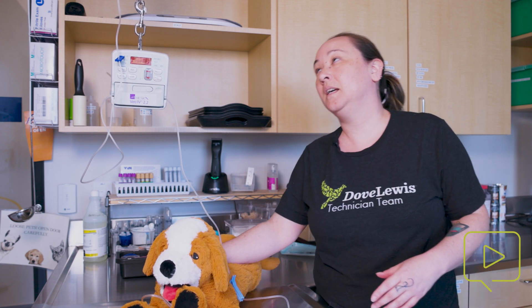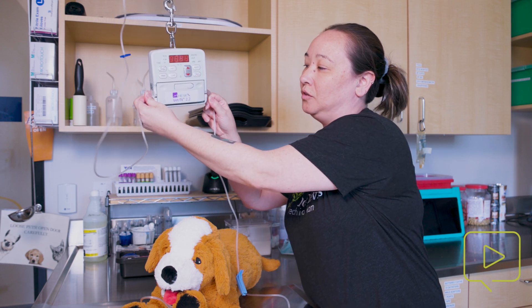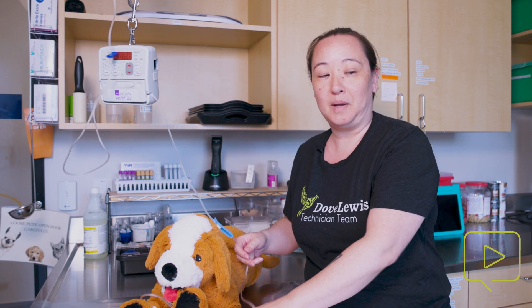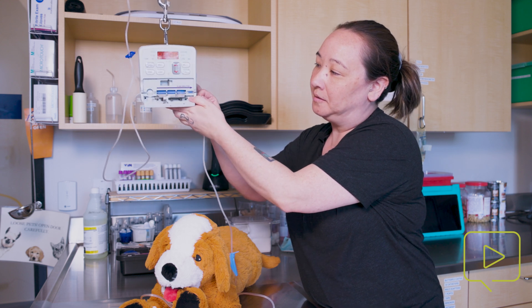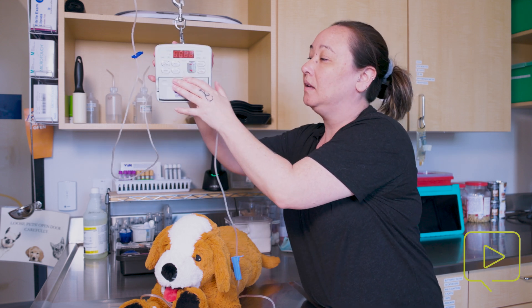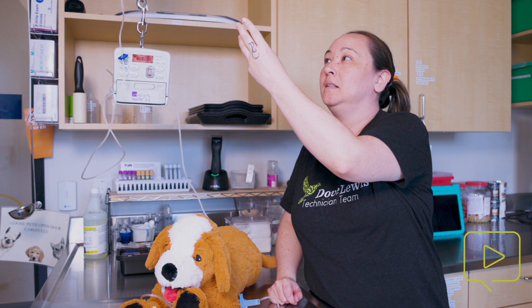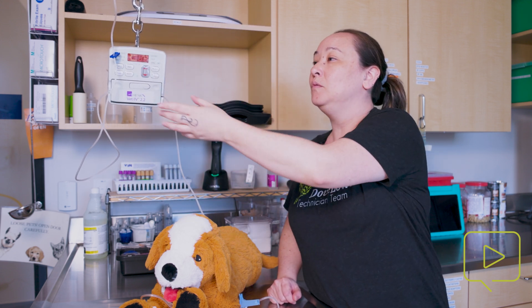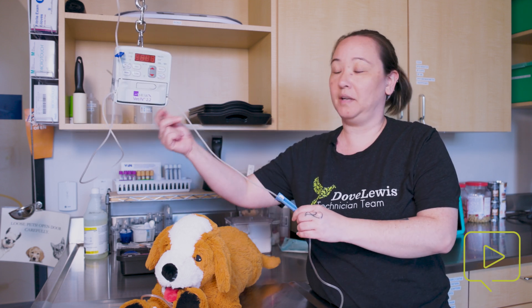What this error means is that there's an error present somewhere along the line. That can mean there is an occlusion either above the pump, at the door, below the pump, or at your patient. Really, all it means is that the sensor in here is detecting an air bubble. Some reasons that might happen: your fluid bag has run out and fluid has continued to move through the line until the error occurs, or air builds up down the line and creates a bubble.